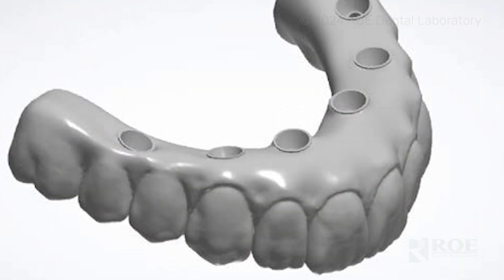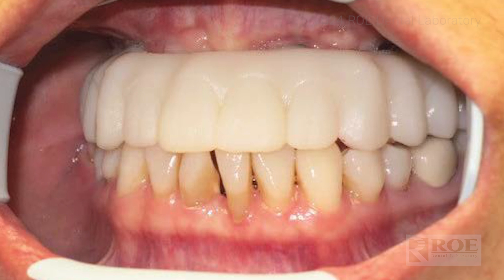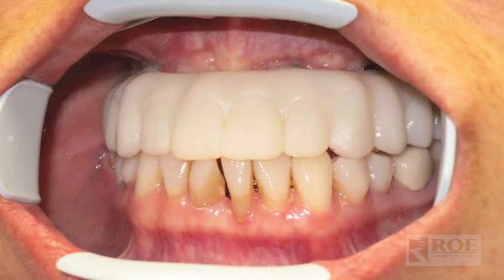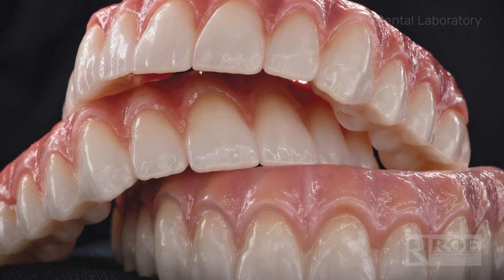Your next appointment is going to be your printed triad, so you're getting closer. This verification jig and bite rim appointment is roughly an hour and a half — a longer appointment — but then you're on your way to the fixed final restoration. Everything is listed in this book. There are other ways to do this, but if you want to go down this full analog route, we've got you covered. If you have any questions, please reach out, give us a call at the lab, check us out on our socials, and we would love to do this next restorative case with you.